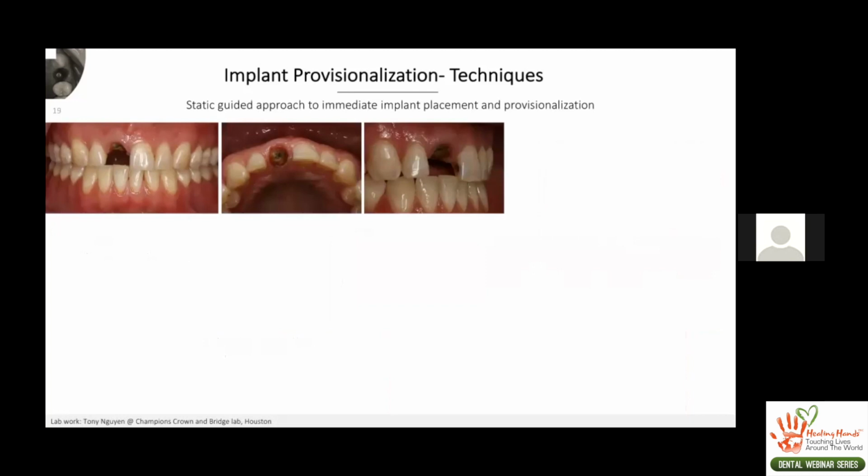If you have a situation where you are able to do a fully guided implant placement, that is, of course, the most important thing. Will this particular situation allow for guided surgery? And first of all, will it allow for an immediate implant? Those are decisions you need to make in the preoperative time. As you can see, this patient has this residual root, and very thankfully, because of it, all the soft tissue morphology has been maintained really well. So we're not expecting much additional grafting, other than hard tissue grafting in the jumping distance between the implant and the buccal bone.